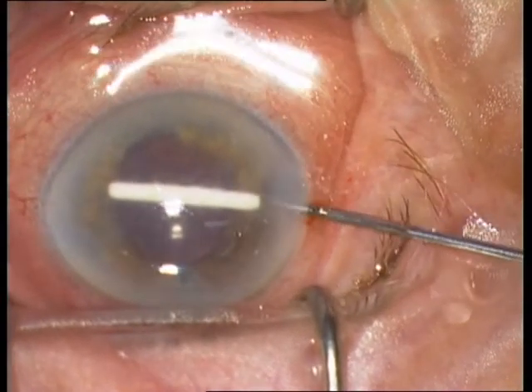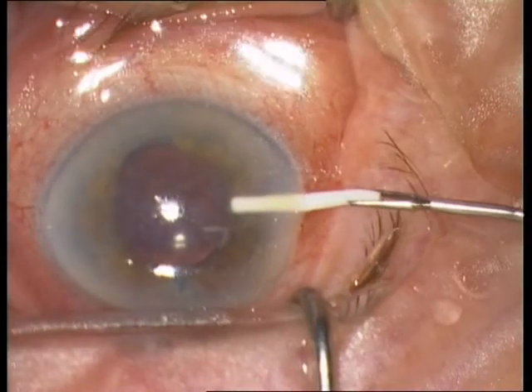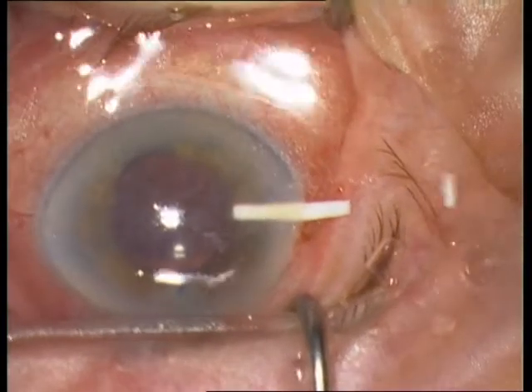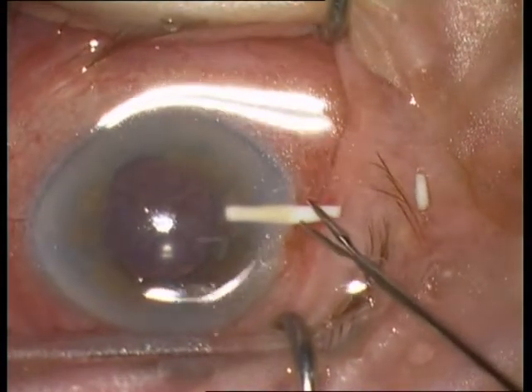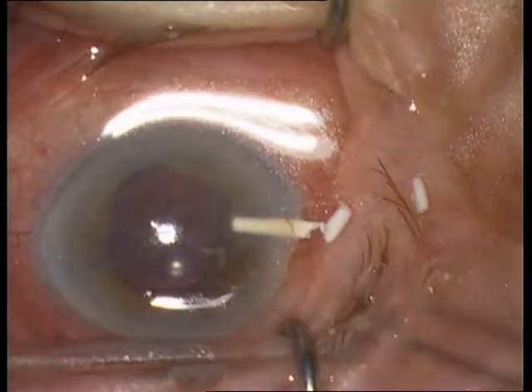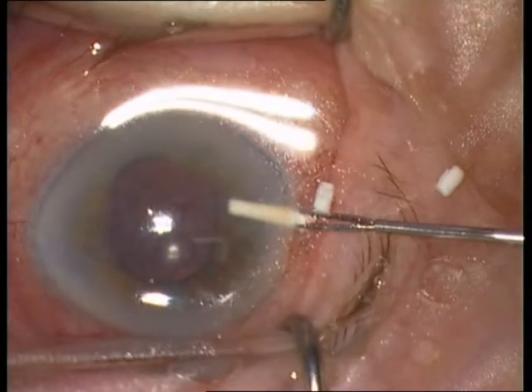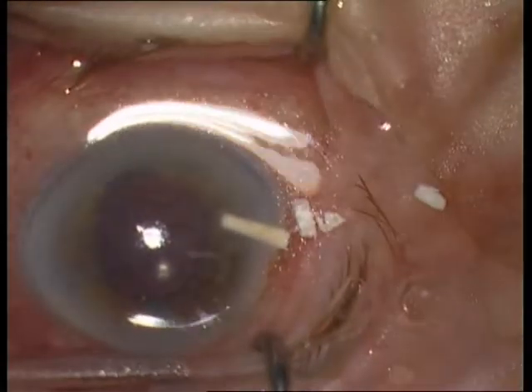I am using a 23-gauge intravitreal forceps. The implant breaks easily into pieces.